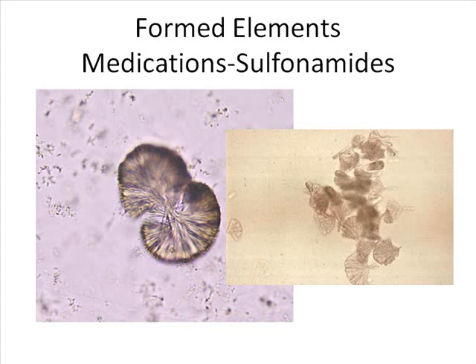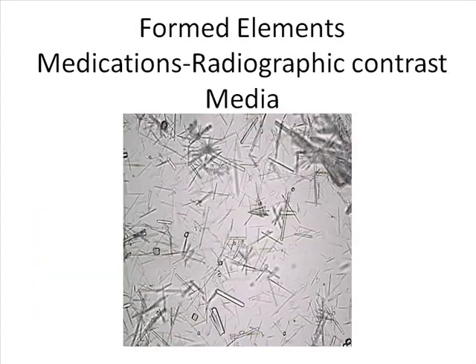If you looked at that calcium oxalate from ethylene glycol, it kind of looks like it, but you can see there's a lot more of them. All right. Once again, as the urine cools is when you're going to start to see this. So if you're looking at urine in the time frame that you should be, you shouldn't be seeing these things because they won't crystallize out in that amount of time.